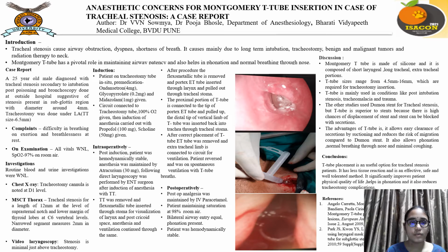Introduction: Tracheal stenosis causes airway obstruction, dyspnea, shortness of breath. It is caused mainly due to long-term intubation, tracheostomy, benign and malignant tumors, and radiation therapy to the neck. Montgomery T-tube has a pivotal role in maintaining airway patency and also helps in phonation and normal breathing through the nose.